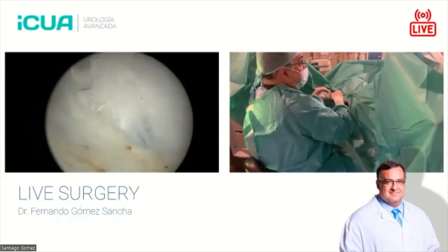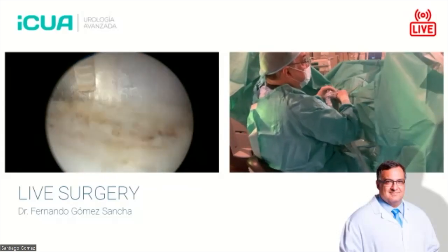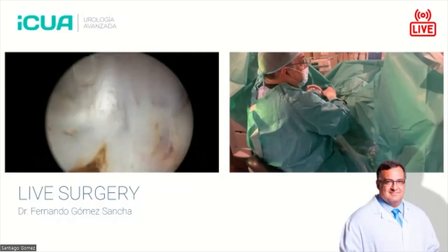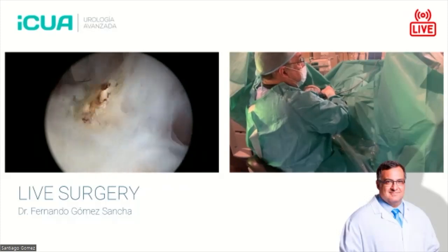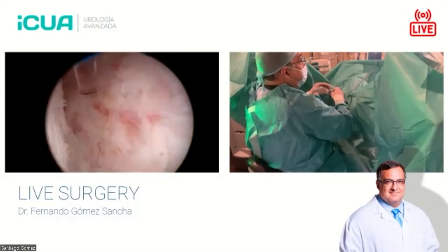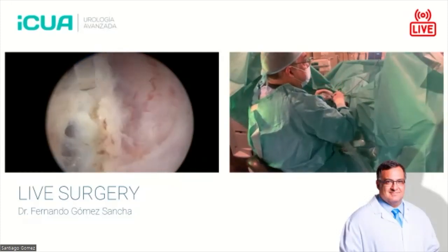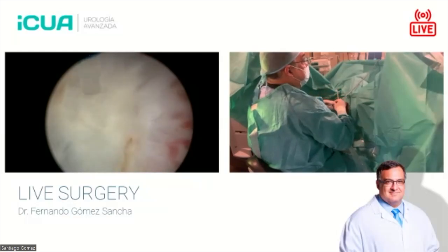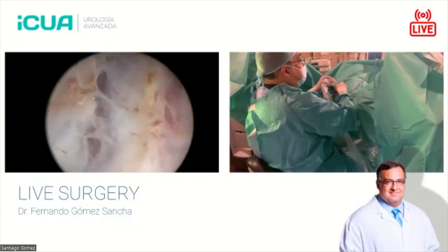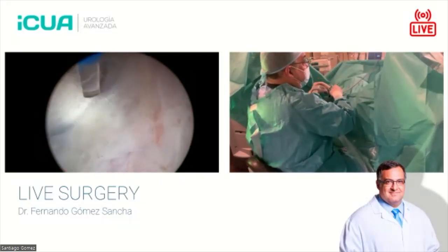The thing is that holmium can emit high energy pulses in a very short time. So short pulses and very powerful pulses. This characteristic is called, well, the holmium laser can emit with very high peak power, you know? And the peak power is the amount of instantaneous energy coming out of the fiber. And it is much higher than what thulium or thulium fiber can offer.